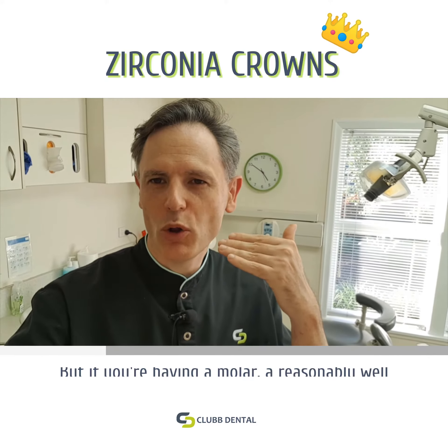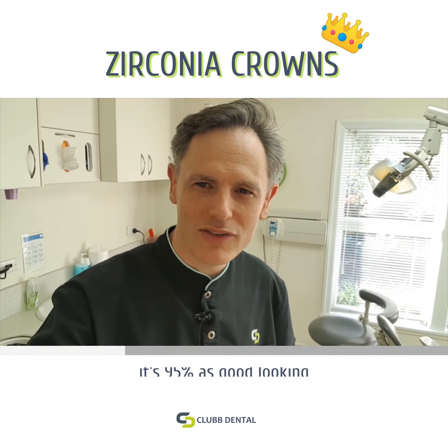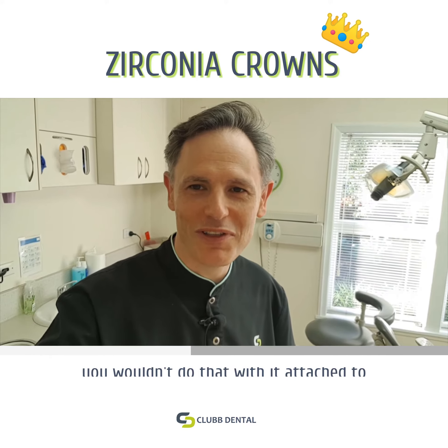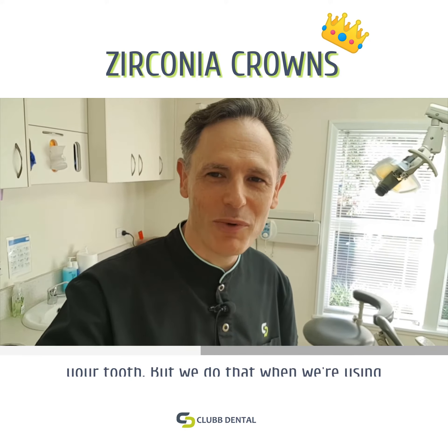But if you're having a molar, a reasonably well-hidden tooth crown, it's 95% as good-looking, and most importantly it's super strong compared to metal — they're that strong. You can virtually hit them with a hammer. Of course you wouldn't do that with it attached to your tooth, but we do that when we're using our CEREC machine there in the corner.